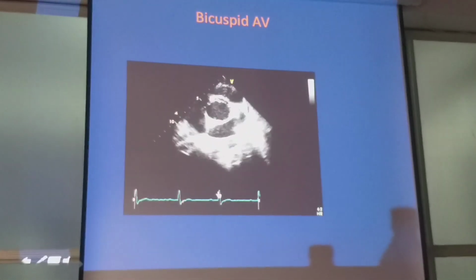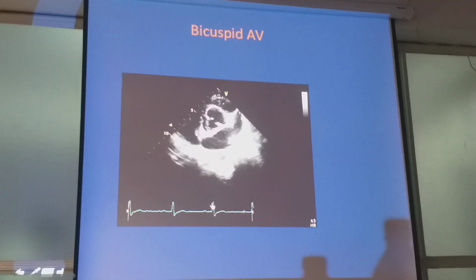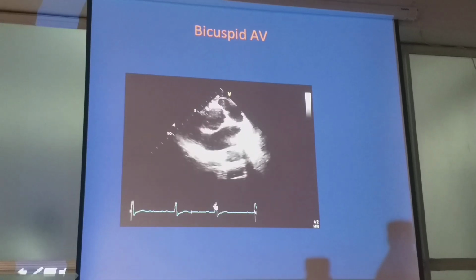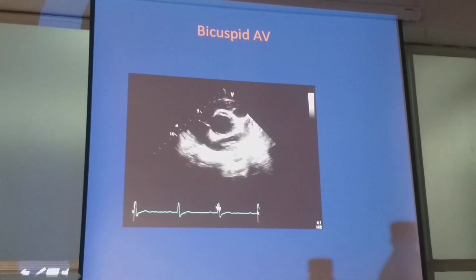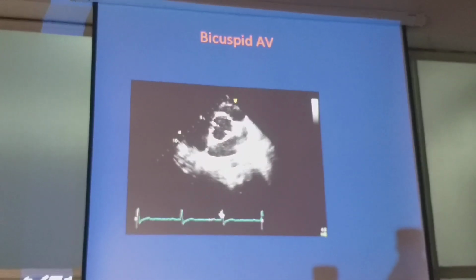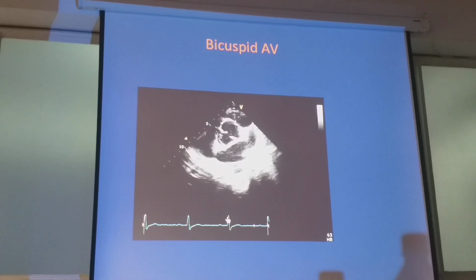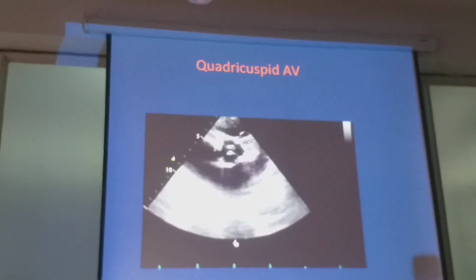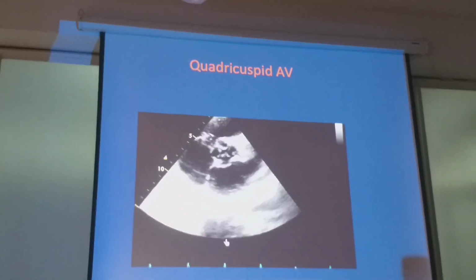Okay. Now this is bicuspid. See? Bicuspid aortic valve. Can you see? Yes. And look at the number of cusps when the valve leaflets are opened, not during line of closure, because often there is raphe which gives an appearance of a leaflet. So, have you seen this valve? You have seen before? No. So, quadricuspid, right?